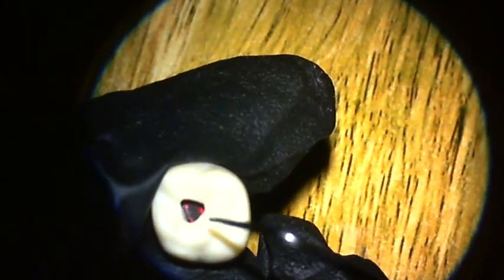Basically, I have a too conservative, under-outlined cavity that I need to expand. So straight line access means that you can access the canals without too much tilting to the opposite direction.